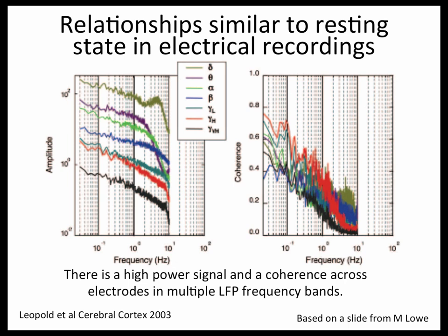The last thing in this field area is, a lot of the electrophysiology work is always about fast signals. People talk about stimulating something for 50 milliseconds, you see your neurons fire, and they stop firing within 100 milliseconds after that's done. With BOLD MRI, we're measuring things every 2 seconds or so. Things are getting faster, but the hemodynamics are slow, not faster than 2 to 5 seconds or so. So what are we measuring, these slow 5-second drifts, when everyone knows that neurons fire and recover really fast?